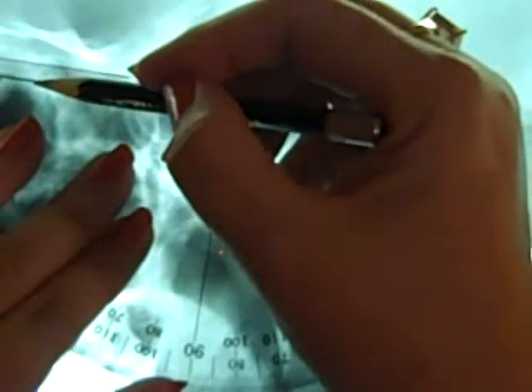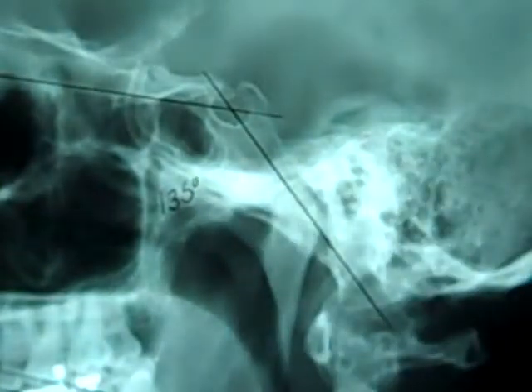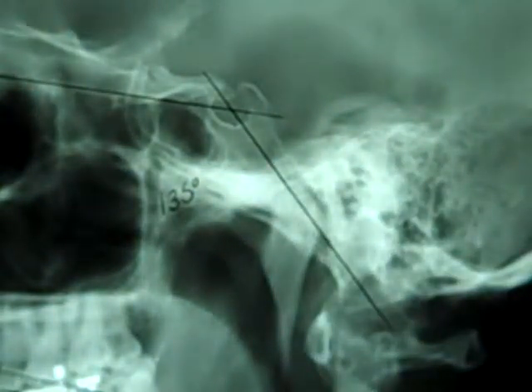Now this one measures about 135. Again, from here to here, and this one measures about 135. Normal range is 123 to 152. If you had greater than 152, you might need to be concerned about platybasia and/or basilar impression.